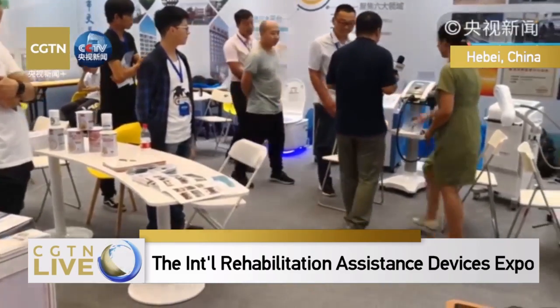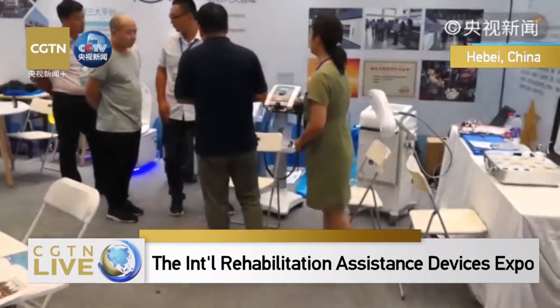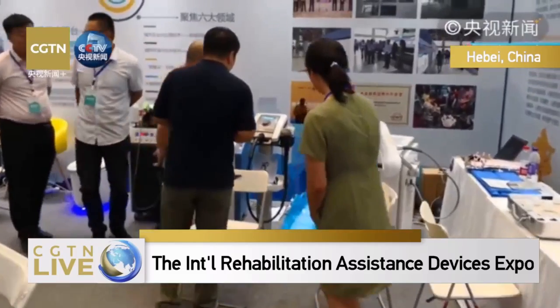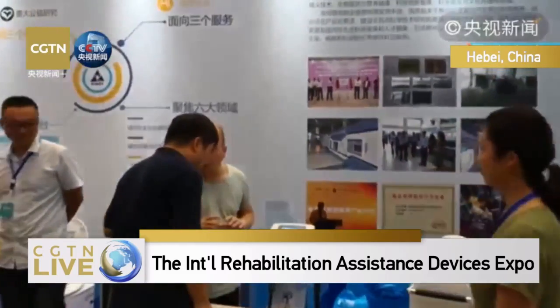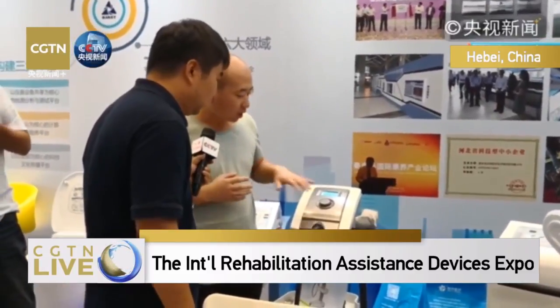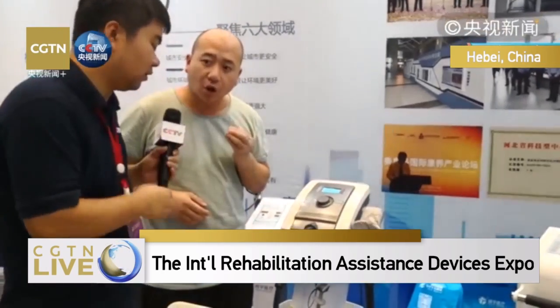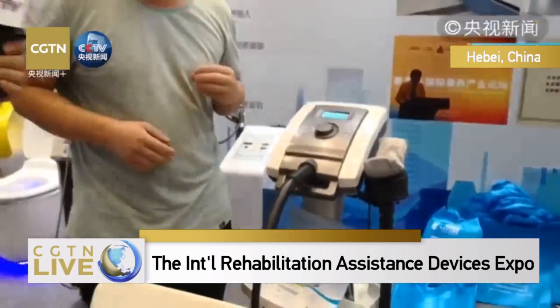This is a big data massage chair. It's muscle therapy robots helping you to loosen your muscle and relieve the strains. If you have some strains of the neck, it only takes about 2 minutes to help you relieve yourself from the strains.